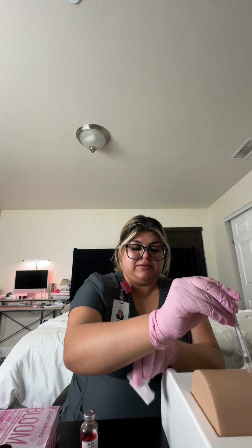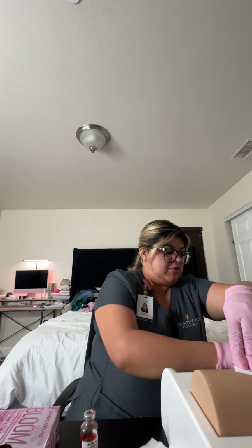Okay, we're going to grab one of our gauze. We're going to gently remove the needle. We're going to dispose of that in the sharps container, and we're just going to put the gauze over it, not apply too much pressure.